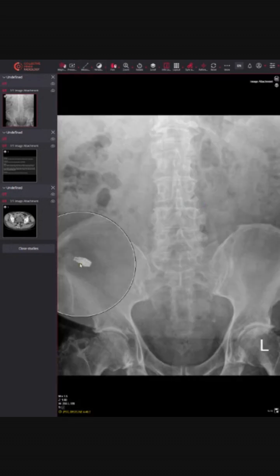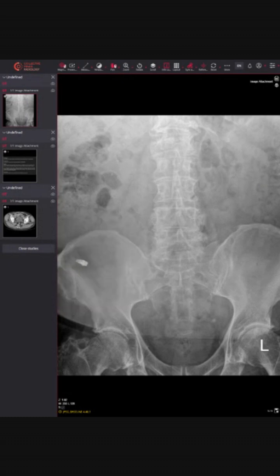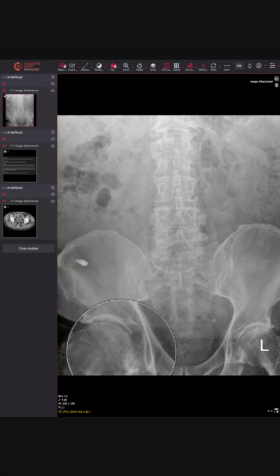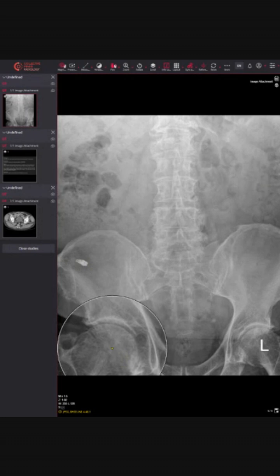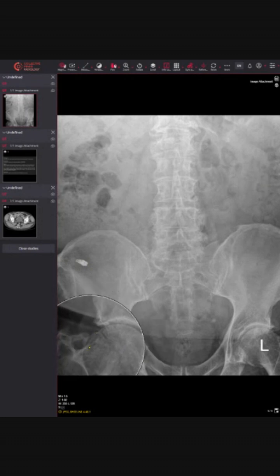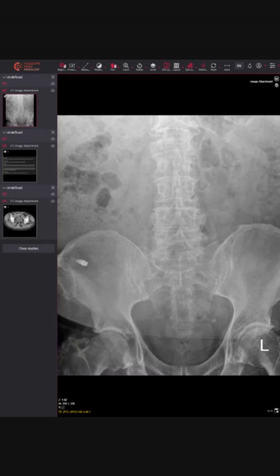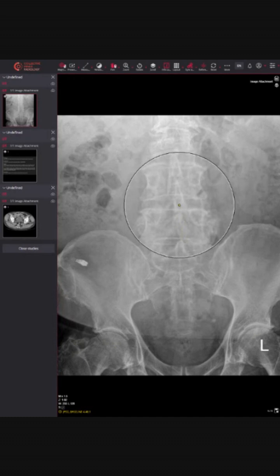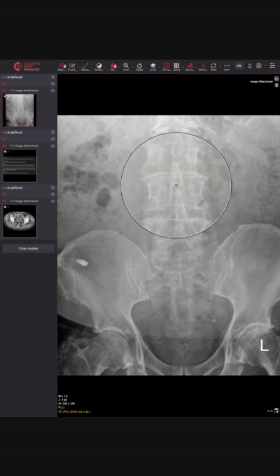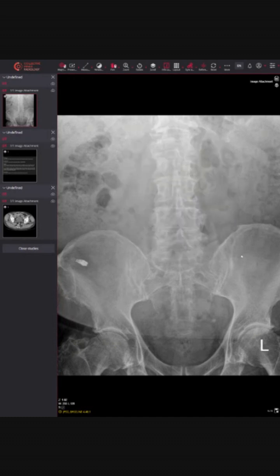Other features: there is an external zip artifact — we get those quite a lot, worth mentioning. We've got some moderate degenerative changes at the hip joints and we've also got some cam morphology, where you just get a little bony outbulging at the femoral neck — might do a feature on that later. And we've got some moderate degenerative changes at the lumbar spine: osteophytes, some end plate sclerosis, and also some disc space narrowing.